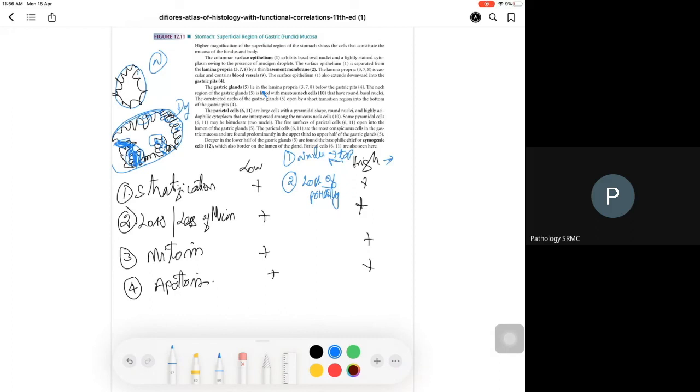When the micropapillae are coming and when they are fusing, they will form cribriforming. There will be empty space here. This micropapillary proliferation here. So there are 3 empty spaces here, 1, 2, 3. And this is known as cribriforming. So that is the 3rd and 4th criteria.